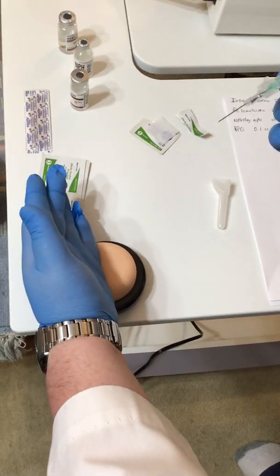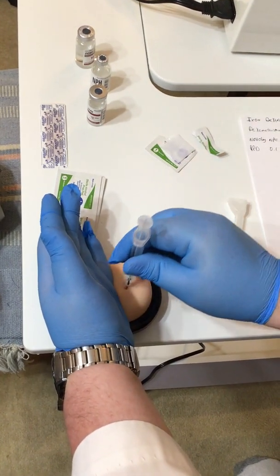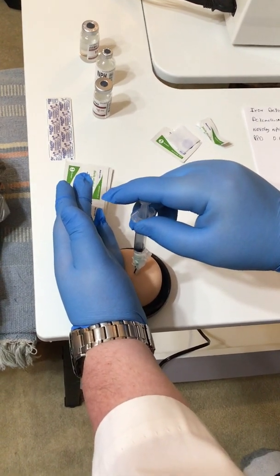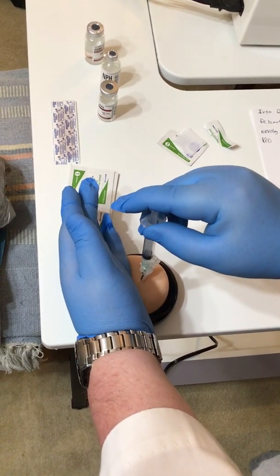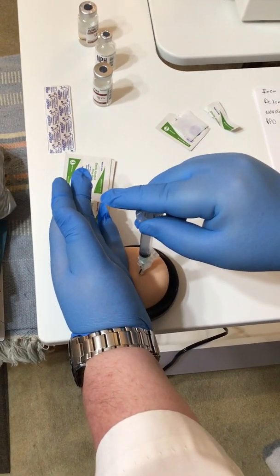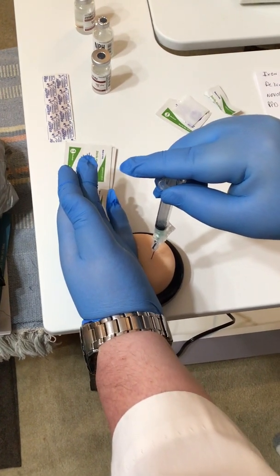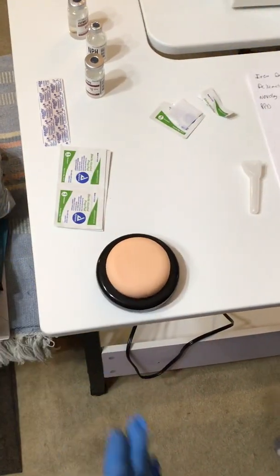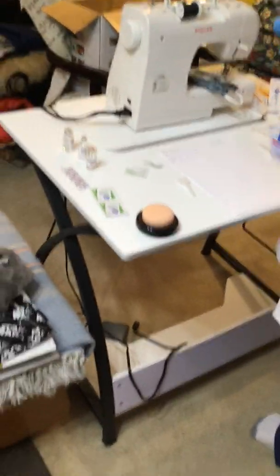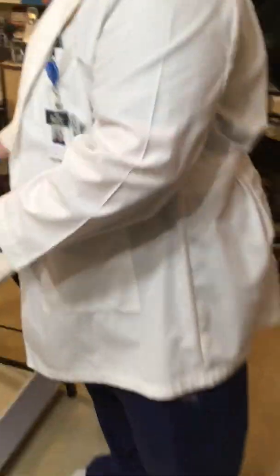IM shots go at 90 degrees, and they dart in. 1, 2, 3. It's a half cc, so I go 3.5 seconds. All right. I'm going to pull the needle out slowly, and as it comes out, I'm going to let go, and it's going to come back. Can you see the needle? We're going to activate our safety device.